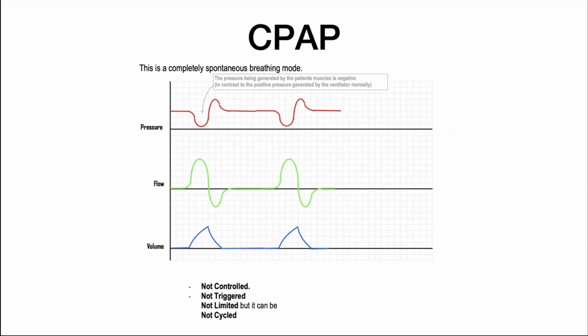So moving on to CPAP, as we said, CPAP helps improve oxygenation. During CPAP, the ventilator or CPAP machine forces a continuous column of compressed air at a fixed designated pressure against the face and nose of the patient who is wearing a mask or nasal cap. When the patient's glottis opens to inhale, that pressure is transmitted throughout the airway, helping to open it. There's no inspiratory flow of air from the CPAP machine. Whatever additional tidal volume the patient pulls in is from the additional airway volume recruited by this pressure.